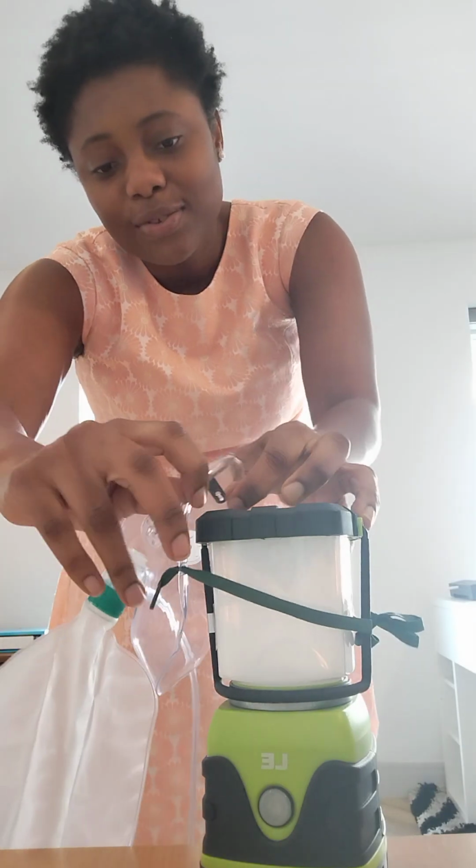Please, you're not going to tie it, okay? Because it's not a human, it's just a torch. So you put this at the back of the head, okay? Then you attach this between the nose and the mouth, okay? Then you are going to adjust the nose brace. That is here. You can press on it. Then you pull the elastic strap here. Then you ask the patient, Jenny, is it too tight? Are you comfortable? Okay. Since you're comfortable, then I think that's okay.